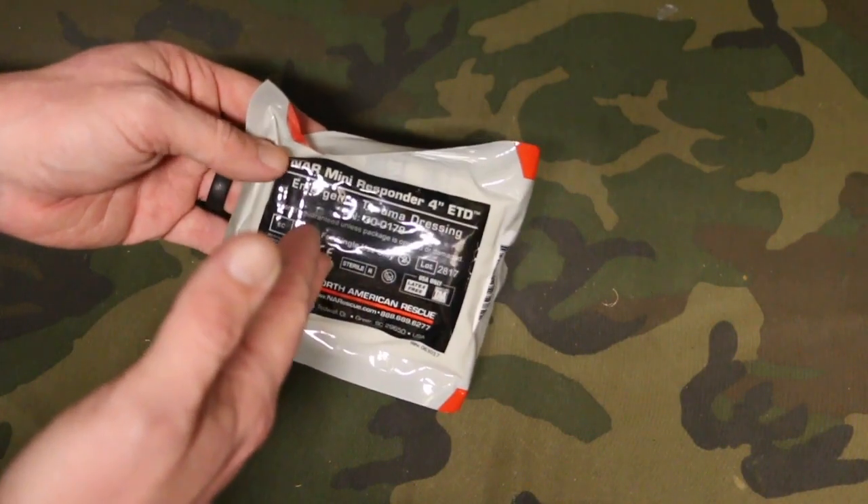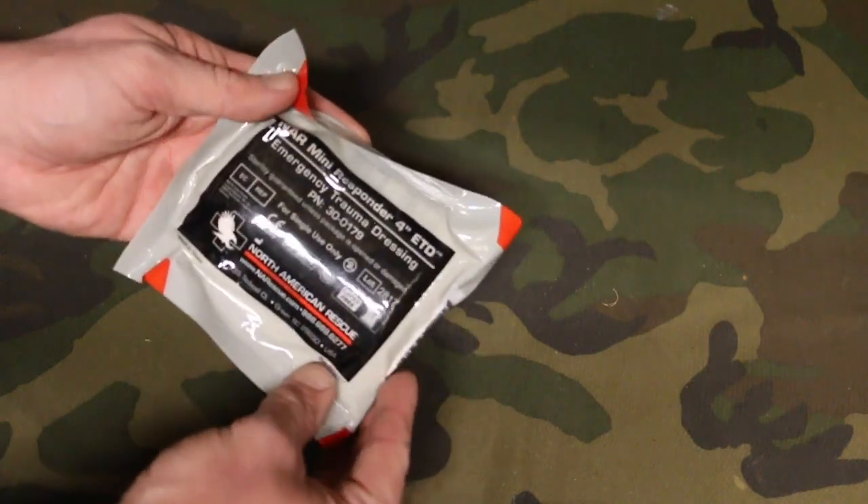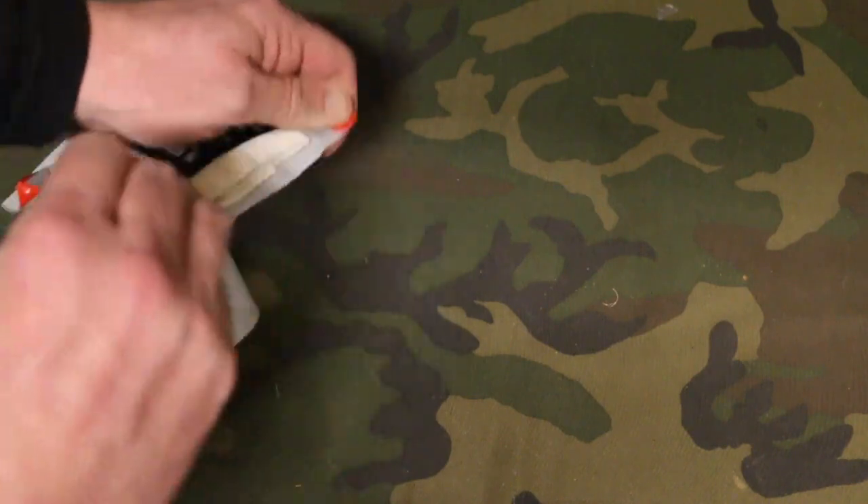This is even smaller than their 4-inch flat they had before. A little bit less gauze but still plenty of gauze to get done what you need to do. It's got a few tear points here — we'll go ahead and open this up so you can take a look at it.